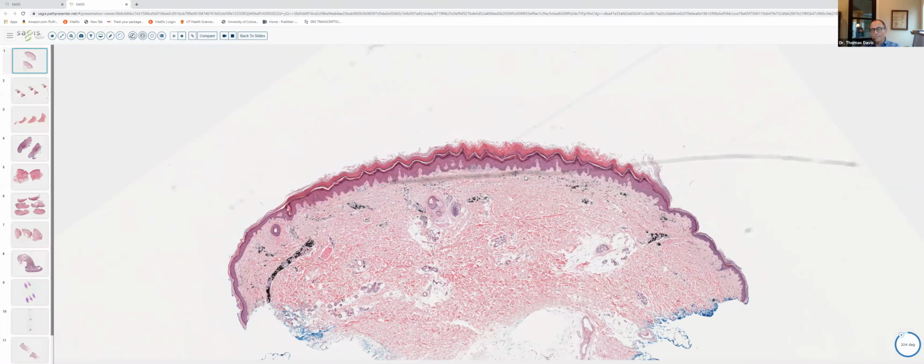You can also get ferrugination of the collagen bundles, and it can induce a pretty brisk inflammatory response with histiocytes, multinucleated histiocytes. It can almost even produce a pseudosarcomatous reaction. And in re-excisions, let's say, of an atypical fibroxanthoma or some type of sarcoma, if Monsel's has been used, sometimes it can be difficult to distinguish this reactive proliferation due to Monsel's from residual tumor. And so it can be a little bit problematic.